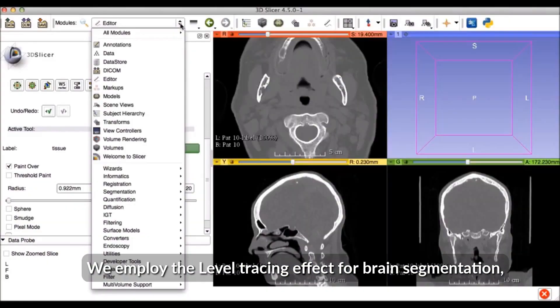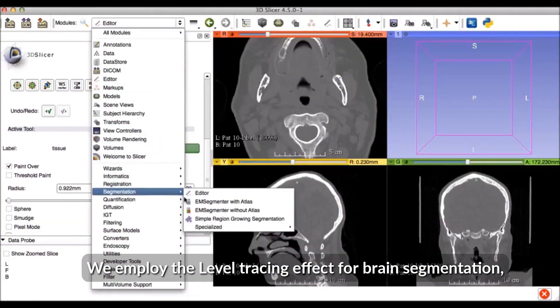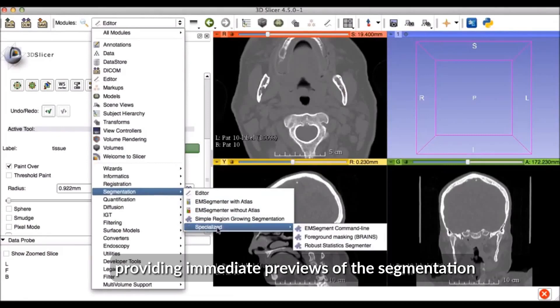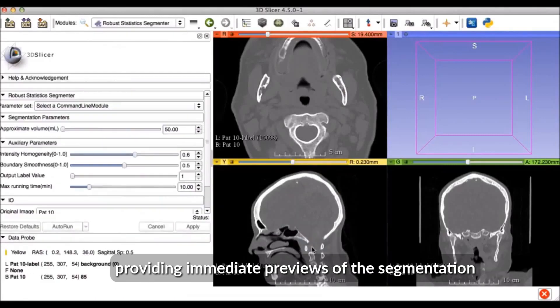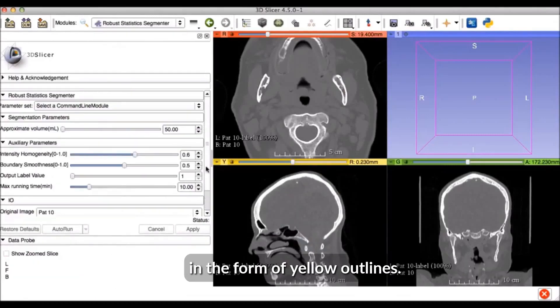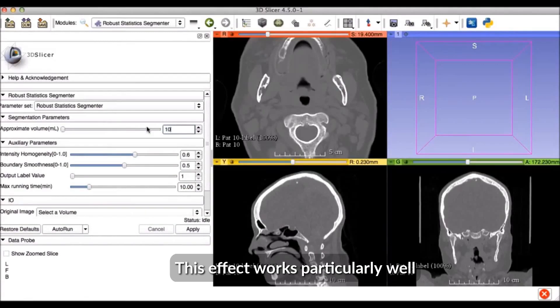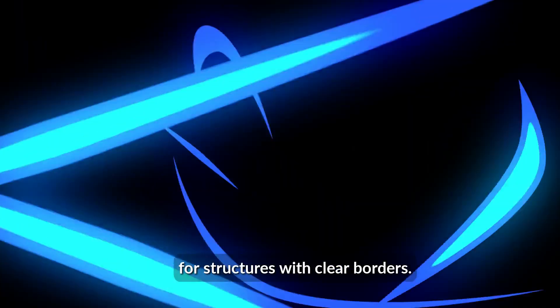We employ the level tracing effect for brain segmentation, providing immediate previews of the segmentation in the form of yellow outlines. This effect works particularly well for structures with clear borders.